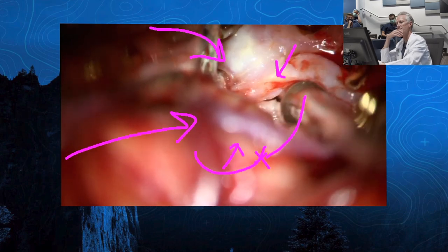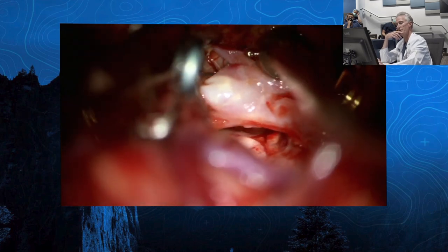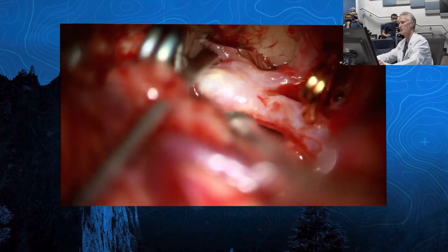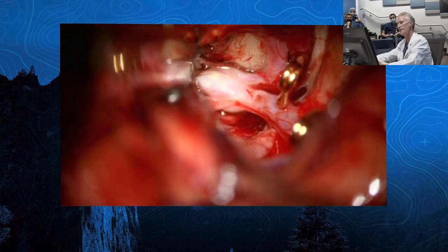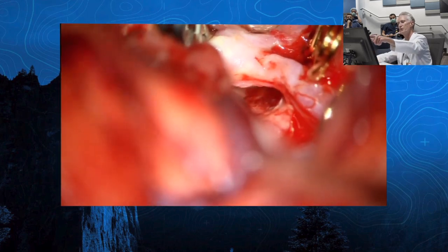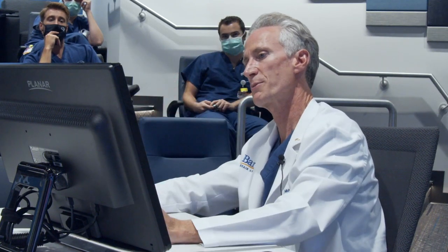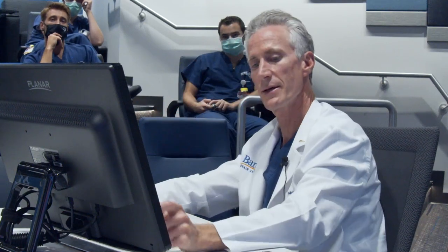And then I've got to make sure I get all the way across to where that dome of the aneurysm ends. You can see it's really difficult to line that up. This clip isn't quite far enough advanced — when I look right at the tips, it's not quite there. There's just another millimeter beyond the tip, so we advanced it and that took care of it. But that's a really awkward clip application because your clip has to kind of start here and advance down. It's a tough one to line up and get the angles right, but that was the ideal clip for that because it goes down the backside and spared the perforators.